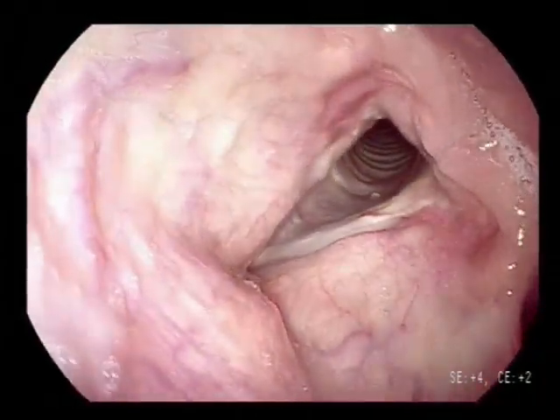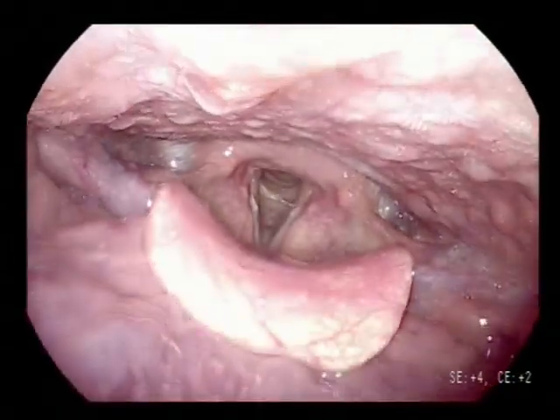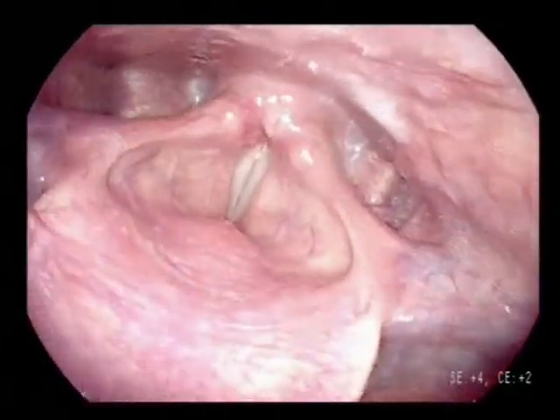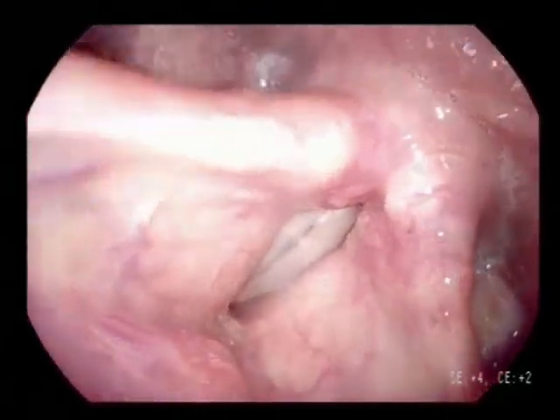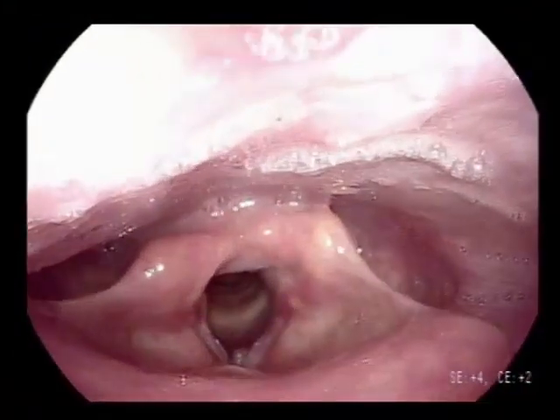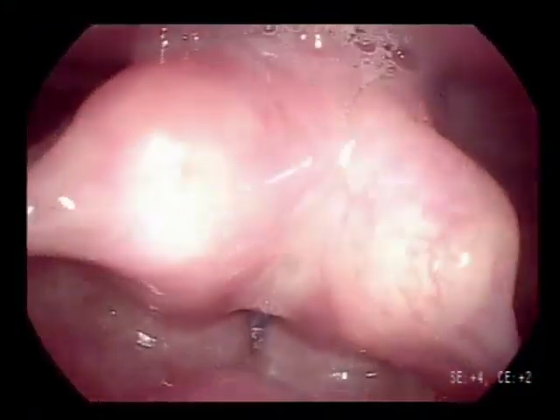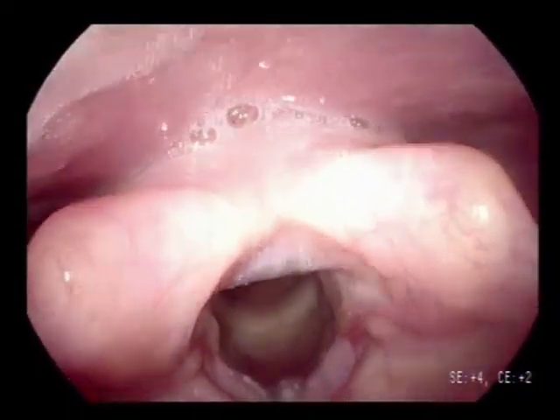Start your examination from the base of the tongue and examine the supraglottic structures. When examining the glottis, let the patient phonate and move the camera to the arytenoids. Afterwards, let the patient breathe normally to provide a clear view of the vocal cords. By tilting the tip of the endoscope anteriorly, you get a better vision of the anterior commissure.